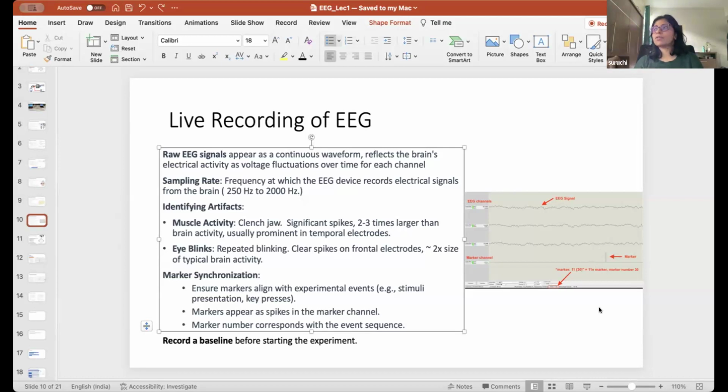See, the thing is, when you say Yog Nidra started, it is not like everyone is going to do something synchronously and immediately go into some kind of samadhi. It's not happening, right? They're doing some slow, gradual thing. So that exact sharp point is not needed for our type of analysis, but it is definitely needed in ERP analysis, because they want to know exactly what happened 200 milliseconds after they saw the picture.